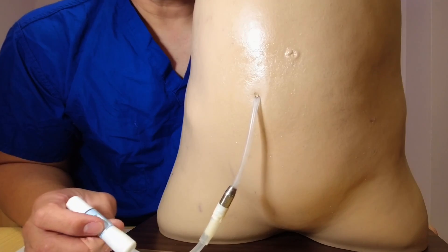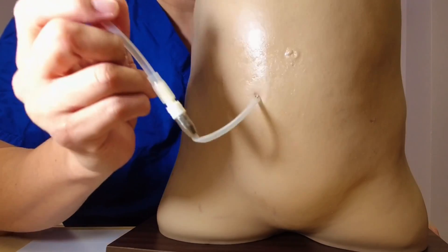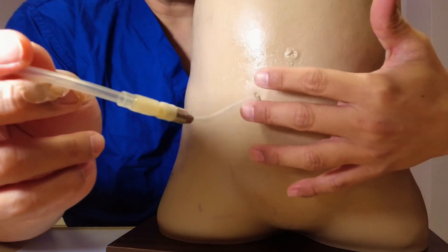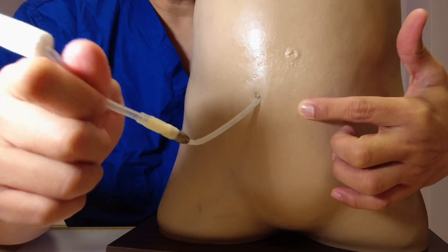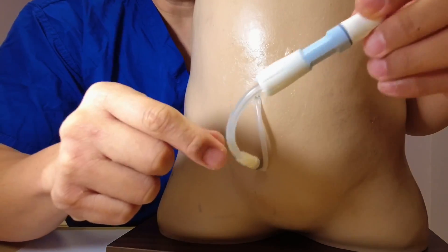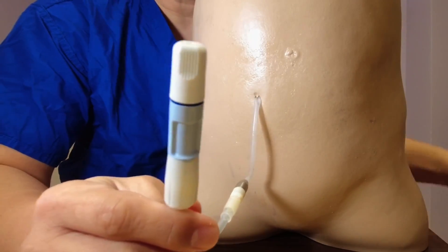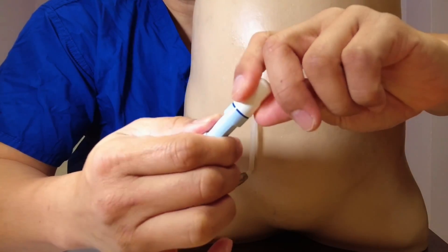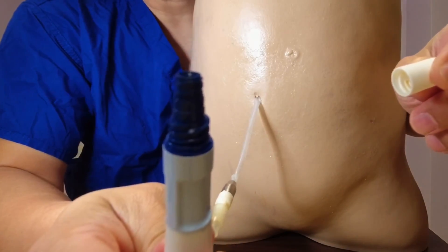I will show you a sample of the peritoneal catheter. As you can see, this is an example of the peritoneal catheter. A tube is inserted into the peritoneal cavity and you've got the catheter outside. This is where we attach the solution — there's a cap at the end where we attach the solution.